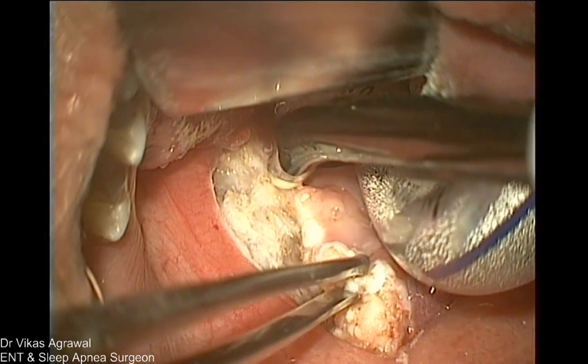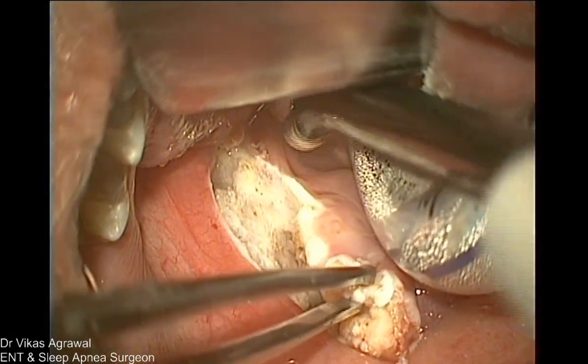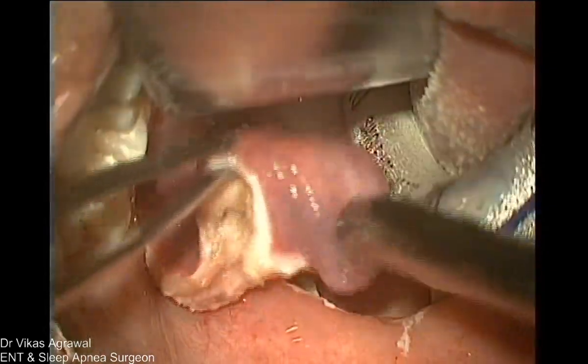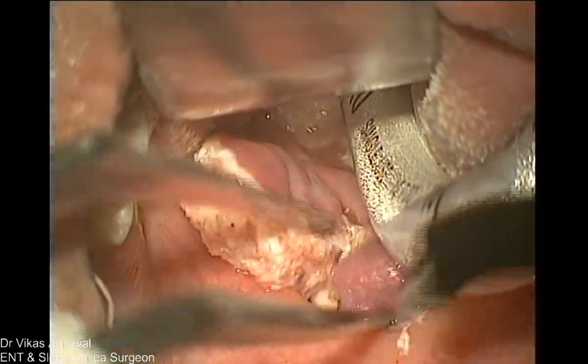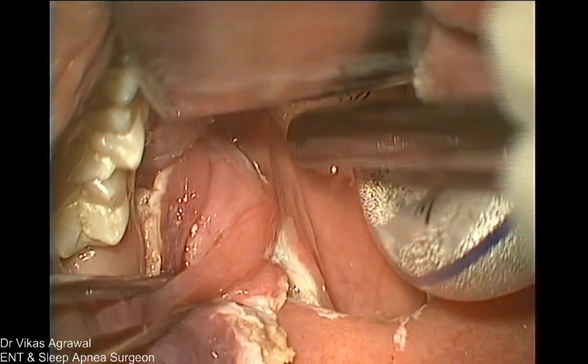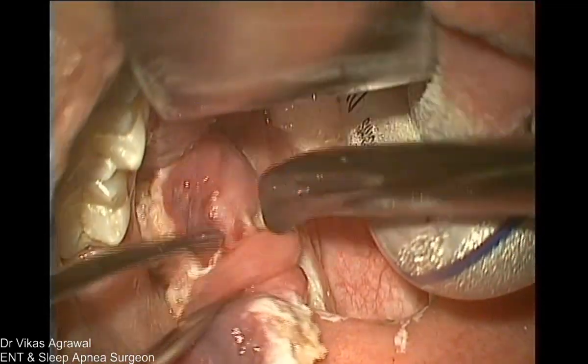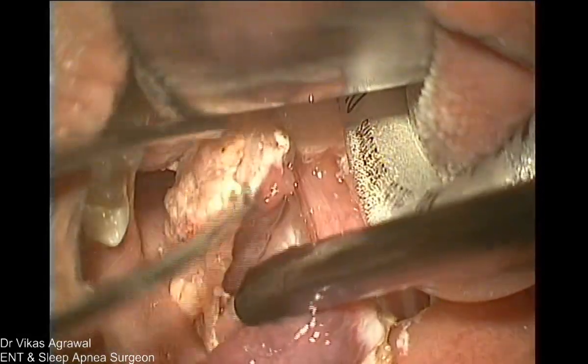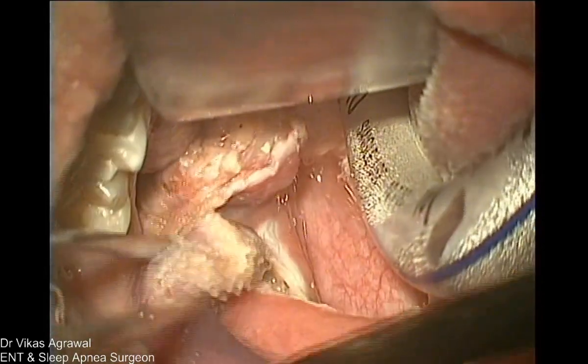So now, okay, this is the posterior pillar, and we have made our plane very, very clear here. We'll see how much mucosa needs to go. Can you see very clearly now? Yeah. There is no business damaging this mucosa, but this redundant mucosa, which was not serving any purpose and was falling, needs to go.